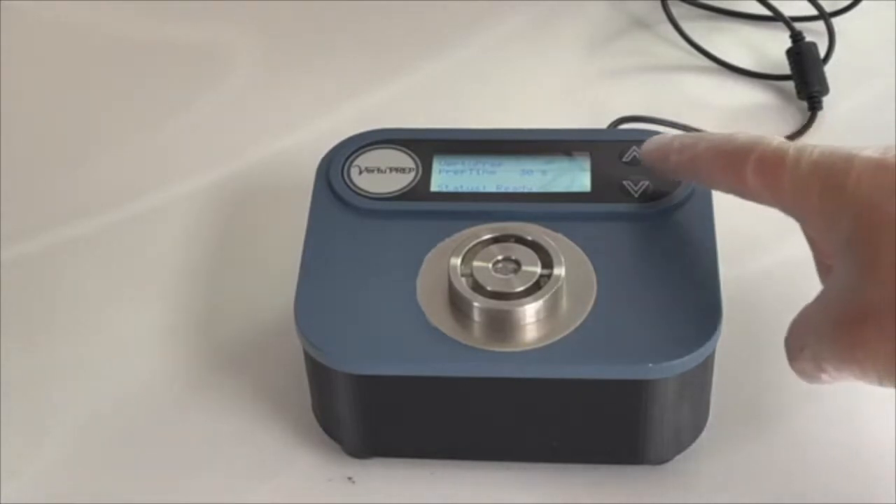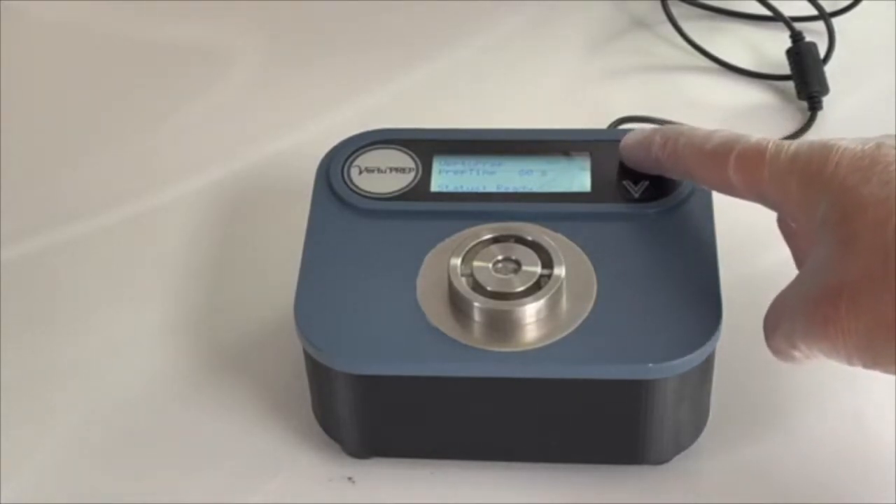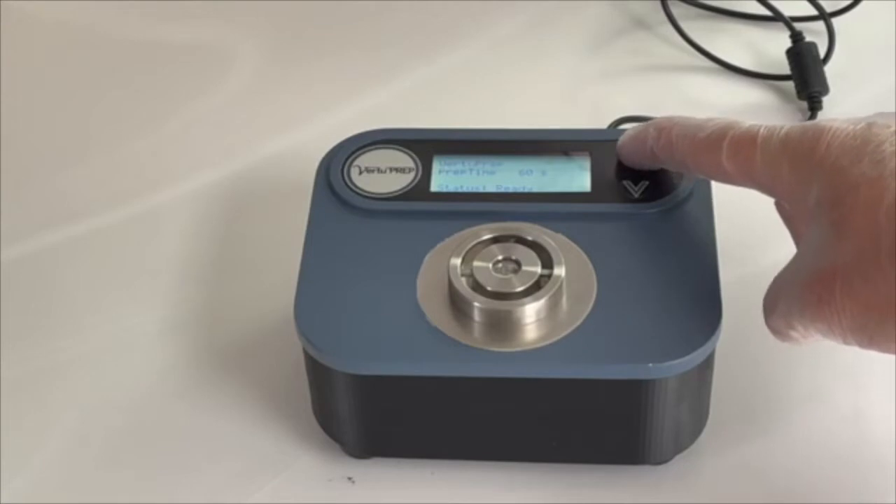Start by adjusting the mix runtime using the up and down arrow buttons on the mixer to match the procedure being used.